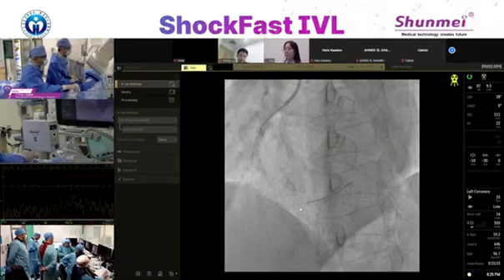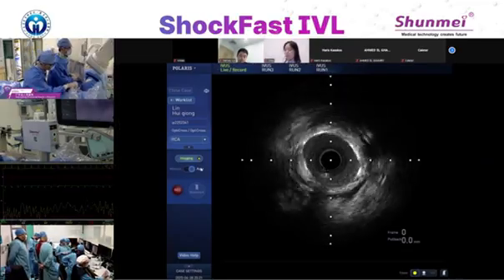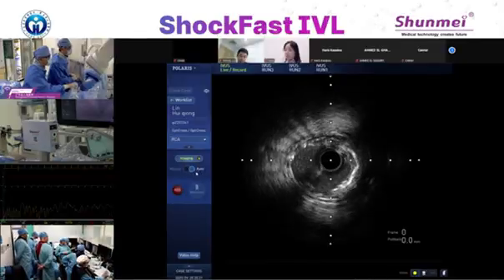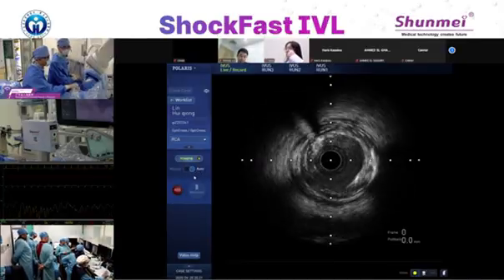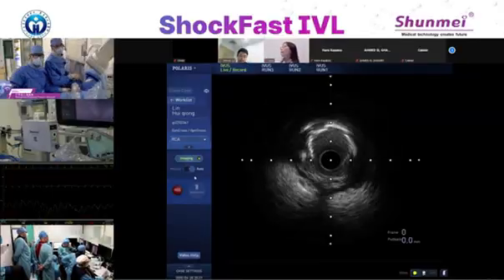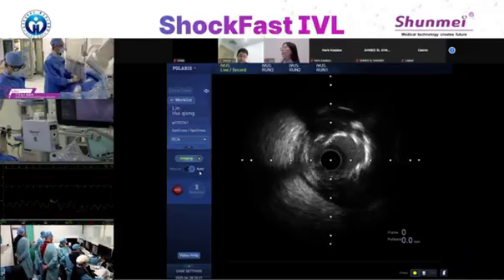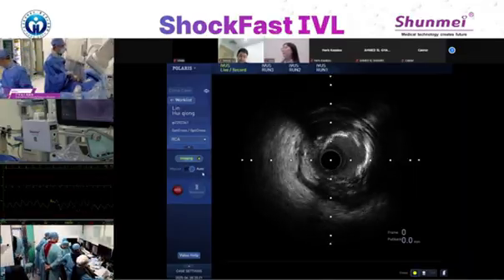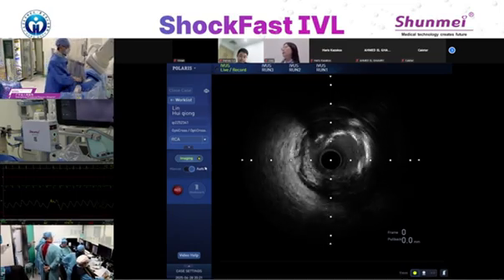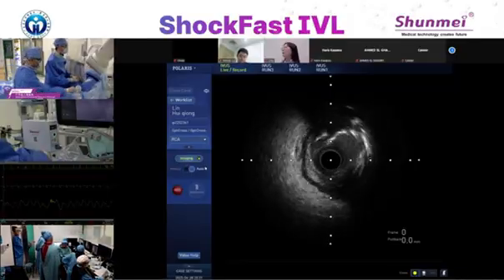Man, come on. Oh, my eyeballs. Come on. Getting crossed. Okay. So I'll pull out my wire to clean the IVUS view.